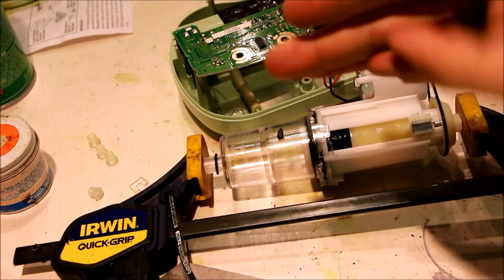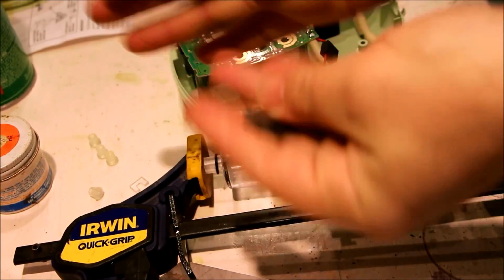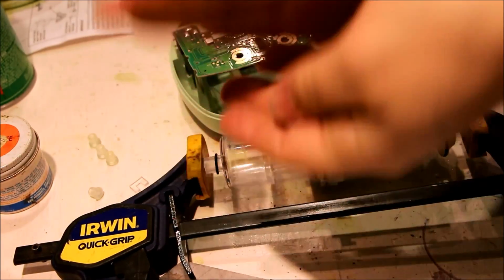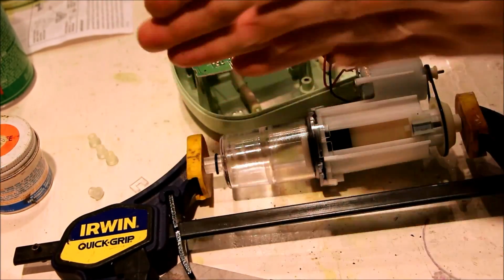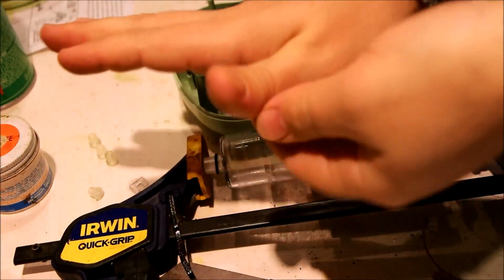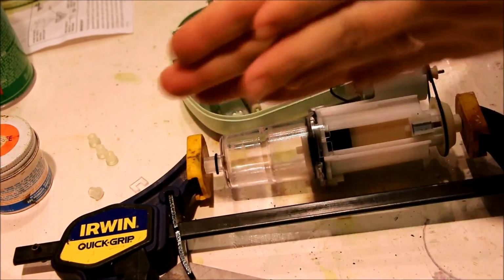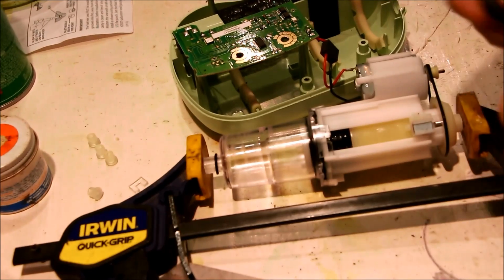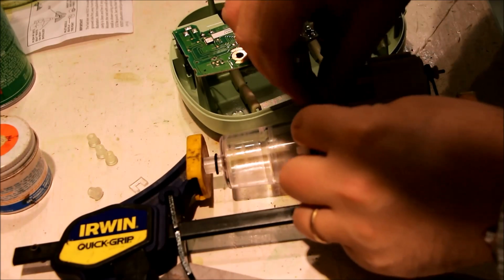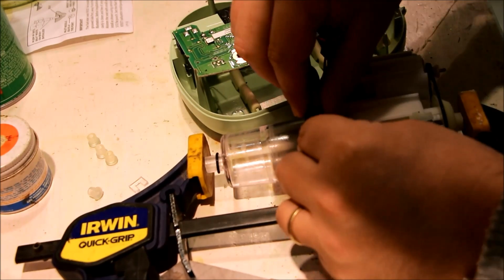Now, the reason I like this stuff so much is I think it's probably epoxy, or some type of epoxy. It actually has steel embedded in it. So this stuff is so hard, it withstands heat, says up to 500 degrees. I think it goes higher. It's incredible. I've had this on my exhaust manifold. And it gets warm in your hands as it's curing. So now, it's actually drillable and tappable when it cures.